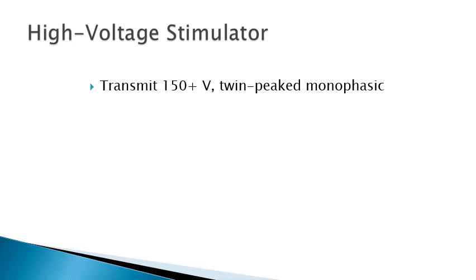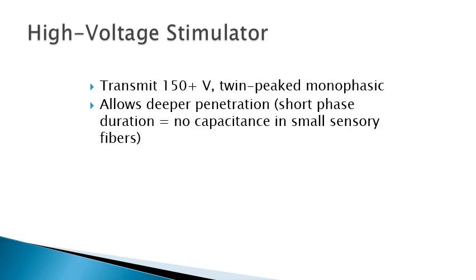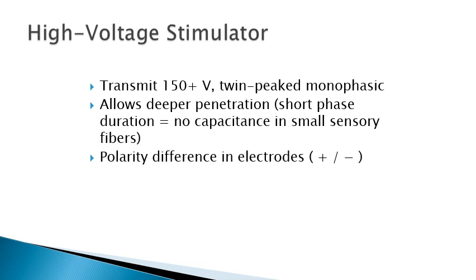One of the things that you have with this, you get a little deeper penetration. There's a very short phase duration with high volt. There's a short duty cycle, so the intrinsic duty cycle is very short. So there's less skin resistance, so it does tend to be very comfortable and does tend to be a very deeply penetrating electrical stim. There is a polarity difference.